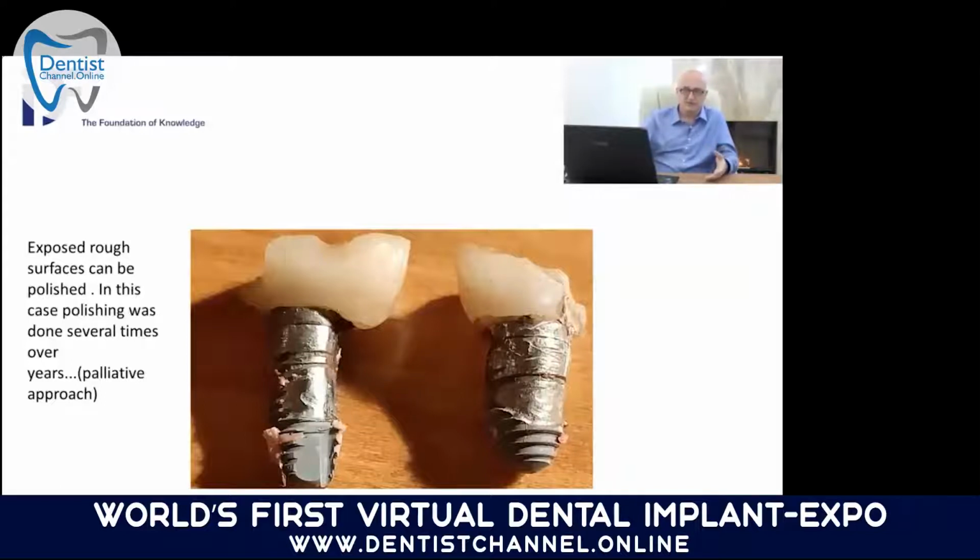It's of course a nice approach. It's good to polish that because if it's polished, not so many bacteria are going to sit on the surface. But on the other hand, down here, on this interface between the implant and the bone, on this borderline, you cannot polish into the border. So it's a nice idea, and it's right to do this. But we have to tell the patient this will not really help. This will not solve the problem. It will only prolong the life of the implants or prolong the suffering, whatever it prolongs. Nothing stops periimplantitis, and the reason are, of course, these rough surfaces when they are exposed.